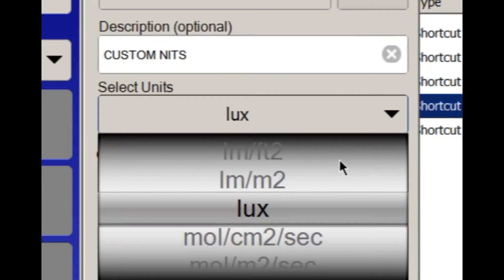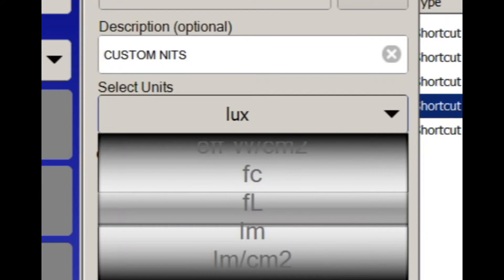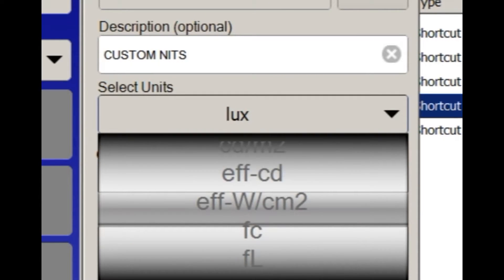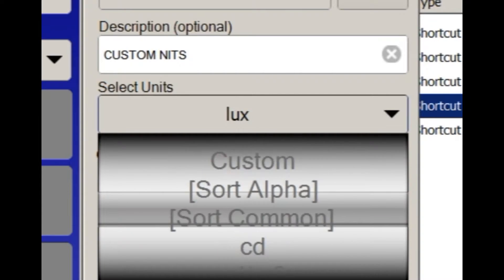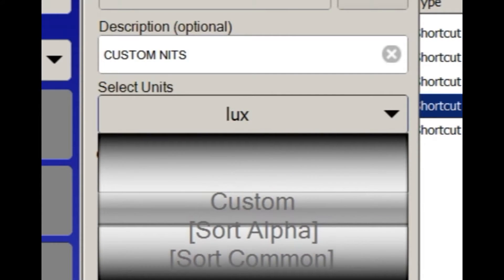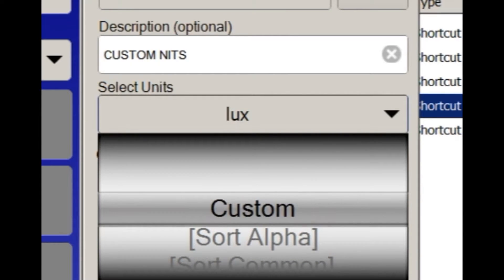Then, use the Select Unit scroll button to select from the standard pre-programmed list. If the preferred units of measurement are not included, select Custom.